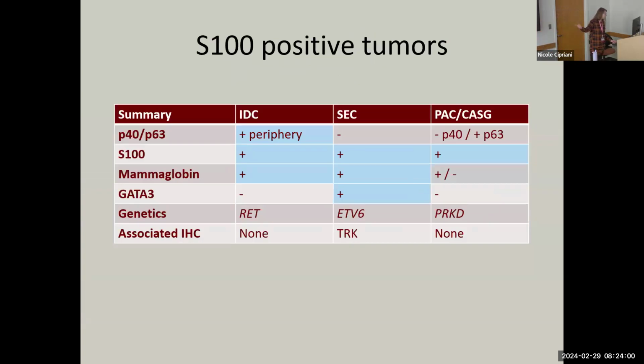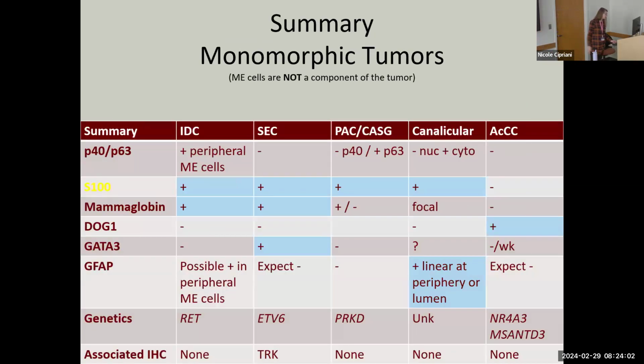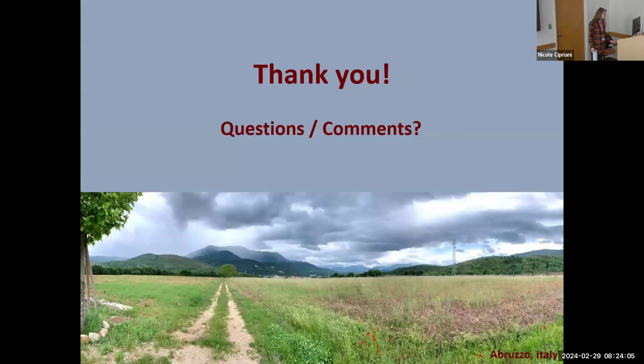I think this is kind of a duplicate because we already have that information up there. So I think that's the end of the PowerPoint. Do you guys have specific questions? Okay. All right, in that case, let's go to some virtual slides.